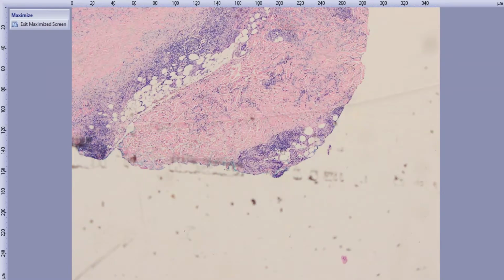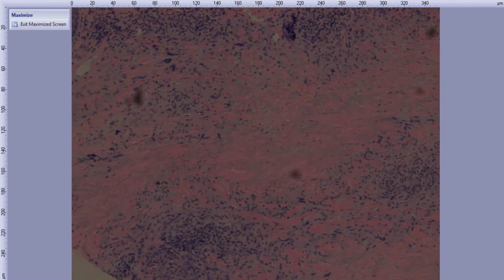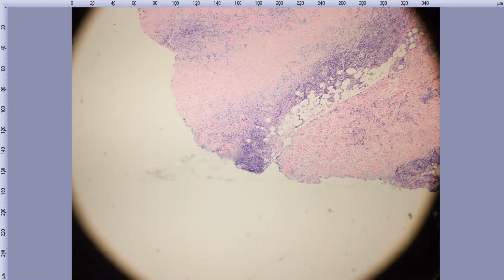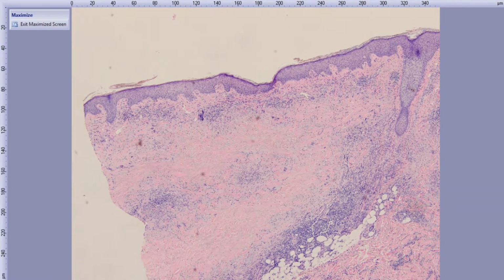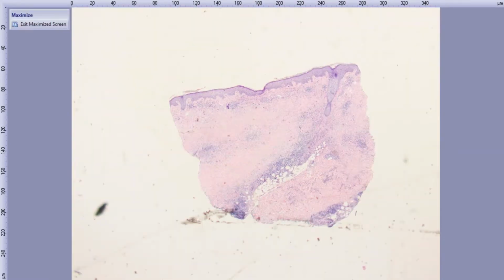But then the main thing, though, in the dermis here, these broad bands of pale acellular collagen with these sort of tiers of inflammation. And this one shows that you can have a lot of histiocytic multinucleated giant cells within NLD, such as here. This had a lot. But yeah, just these broad tiers. Even on low power, if you see anything like this, it's one of the first things you'll want to think of. All right, NLD.